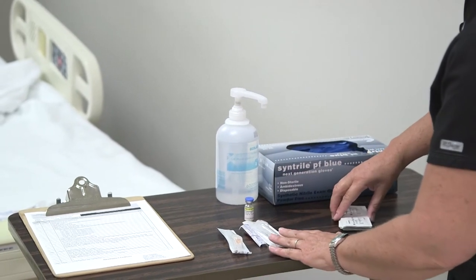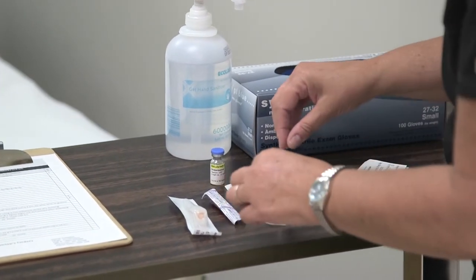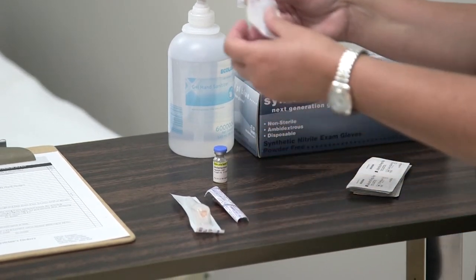Okay, all right, so first you wash your hands. It's not necessary to wear gloves, but if you so want to, you can. Make sure you have a clean space to do your medication preparation.